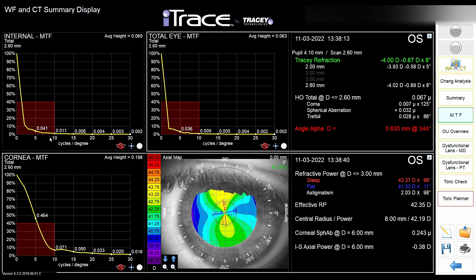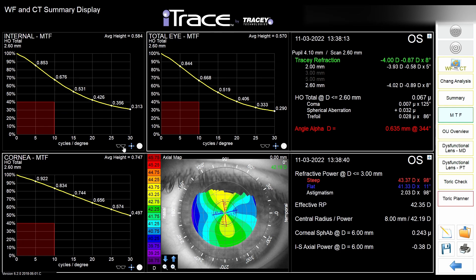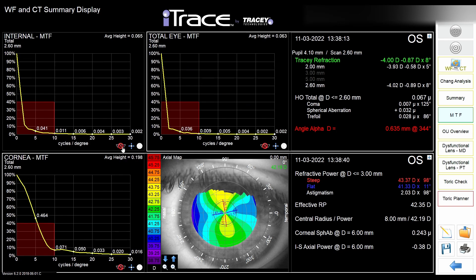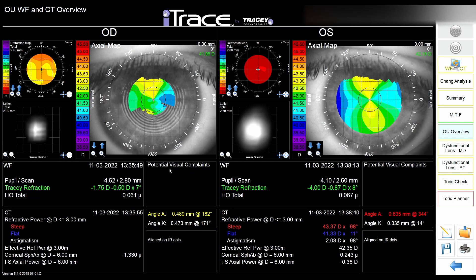You can see how this curve changes when you add spherical correction, and how it changes when you add cylindrical correction. For instance, this patient is not a good candidate for multifocal IOL, but is a good candidate for toric. It just shows you the contrast and doesn't give information about angle alpha — but it gives you a very fast perception of whether you should even consider this patient for premium IOL.